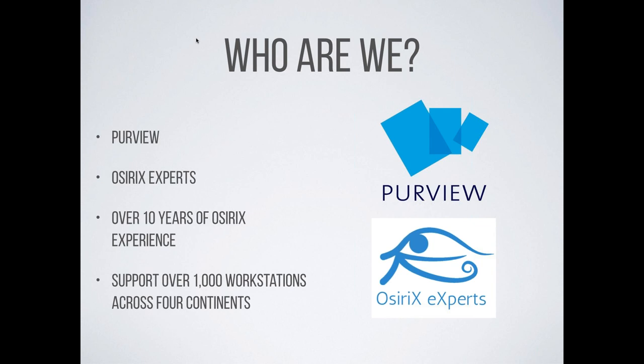I think a lot of people often ask, what's your motivation behind this? Who are you that are making Horos available? The Horos project is really a community of people who make Horos available, who contribute to it, who educate others on it. A great example of this is a university overseas that is using Horos to teach students.